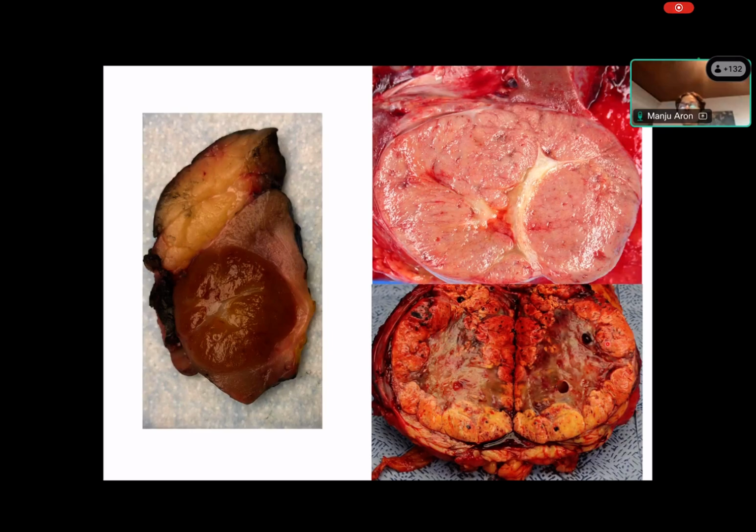Now, clear cell RCCs can show this kind of myxoid degenerative changes in the center of the tumor usually, and you will see this kind of hyalinization of the tumor under the histological on H&E images.